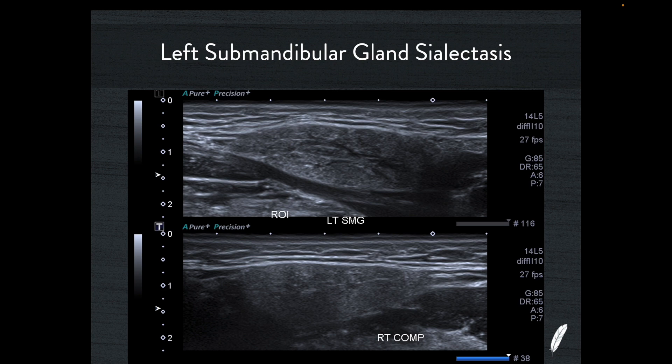When you scan a submandibular gland, sometimes you notice — a bit like a kidney with central echo splitting — there's a little bit of dilatation of the collecting system that's collecting the saliva and channeling it through to Wharton's duct, raising the question about whether there's an obstruction. On left-right comparison, the left submandibular gland has a little bit of this sialectasis change, whereas the right side has a normal appearance.